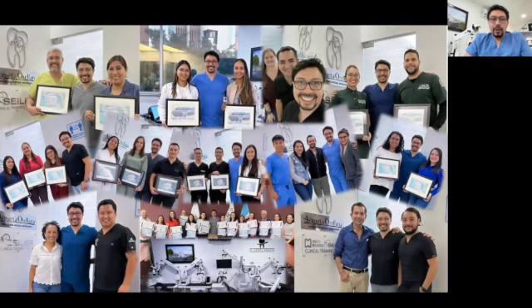We provide personalized courses related to how to use the microscope, related to microsurgery, related to updates in endodontics, in vital pulp therapy. We feel very, very blessed because we have had students from all Latin America, from El Salvador, Nicaragua, Honduras, Mexico, Dominican Republic, and we are trying to help the dental community to understand all the benefits of the microscope in dentistry, and to help them to overcome that learning curve that most of the time tends to be a little bit frustrating and stressful, mostly with the regular microscope, because the regular microscope is kind of difficult during the first days working with it, and we will see why.